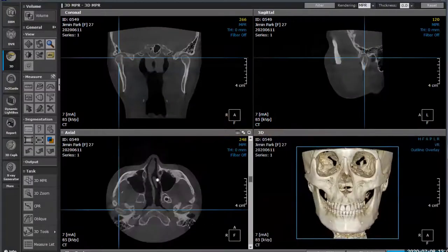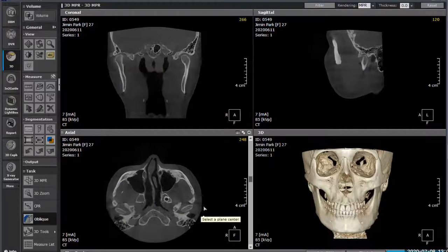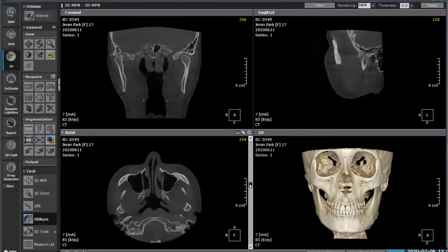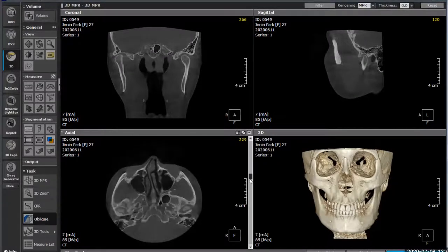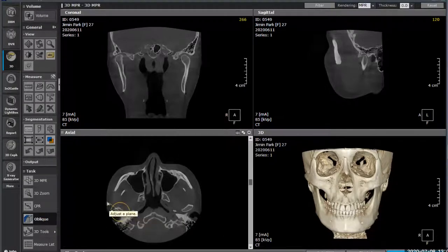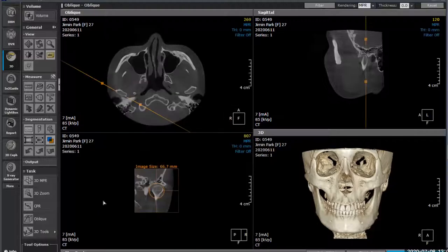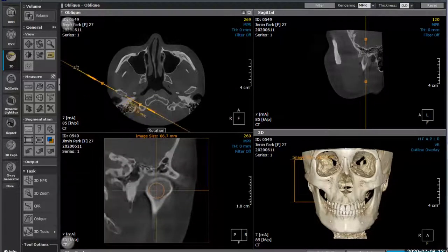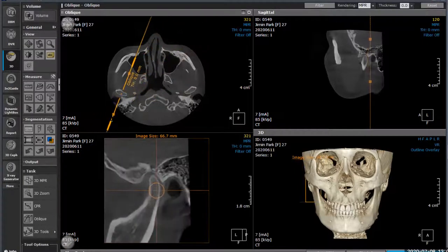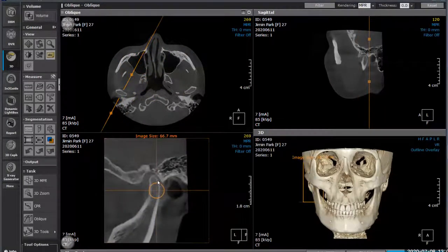Coming back to where we were, we can take the oblique view. I like the oblique view here - there are our condyles. Taking an oblique view like this, I can now look 360 degrees around that TMJ to examine the joint space. We can see in every realm that there's a little bit of lessened joint space in some areas.